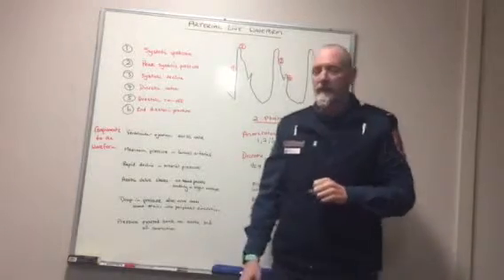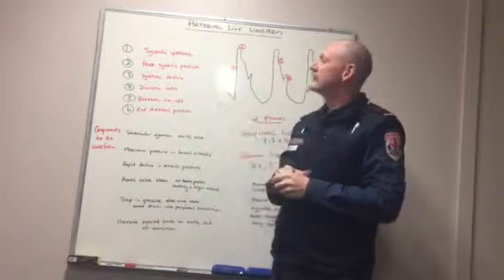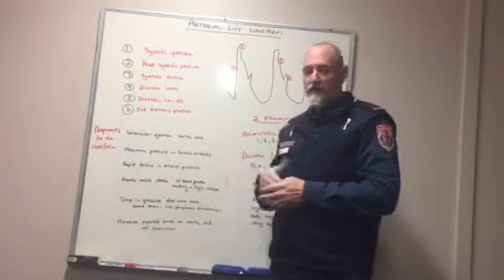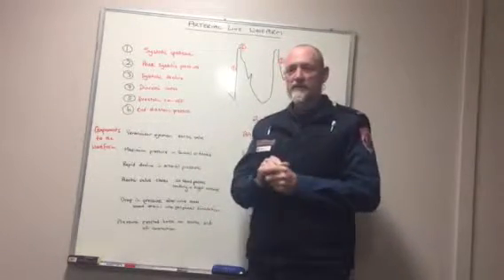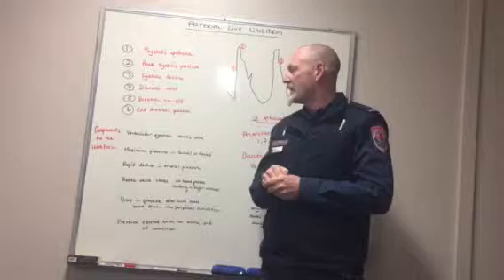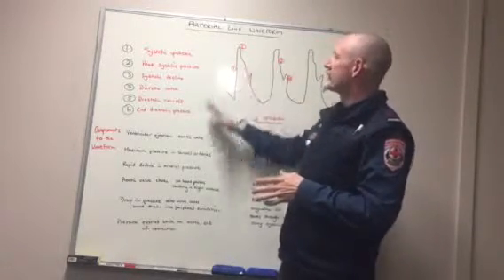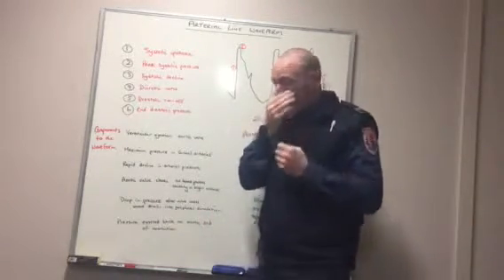Hello, I'm going to do a little short video here this morning in relation to arterial line waveform interpretation. I'm not going to go through what an arterial line is, how it's put in, relative contraindications, how it's actually done, or what the components of the art line itself are. What I'm going to do is briefly go through what a waveform is, what is made up within that waveform, and how we actually read it.